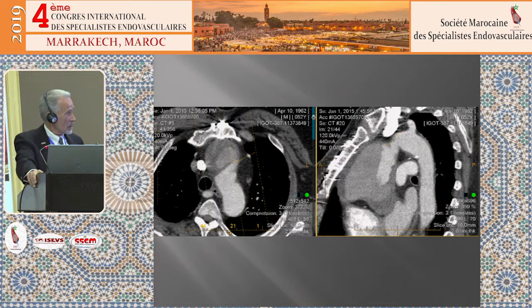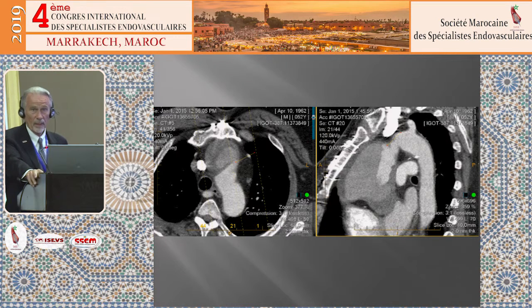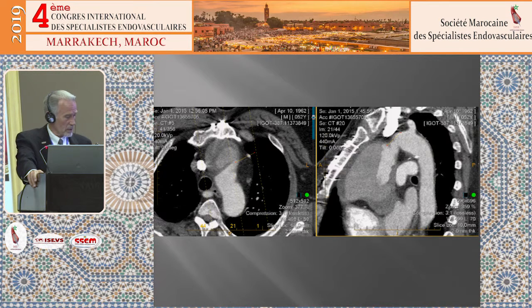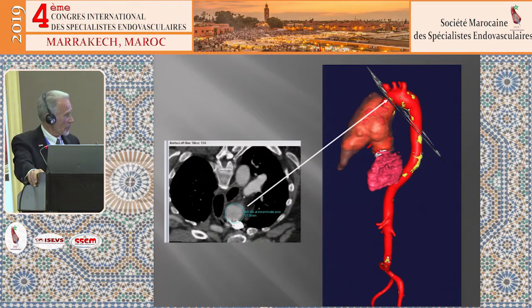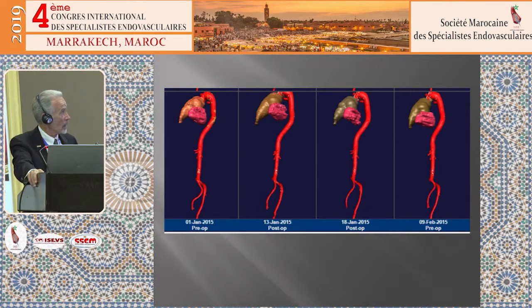Another case, very difficult patient here with a very large pseudoaneurysm. He has a prosthetic valve, which is a consideration to be able to put the device in and pace these patients and then cross the valve to deploy it. And you can see how here above the valve he has a graft which with this pulsatile flow very much collapses, so he's in pretty much extremis by the time we saw him and were able to treat this. We were able to position a device based on these imaging, again just above the valve and up, and this is him over time where he thrombosed that lesion and continues to regress that big pseudoaneurysm.